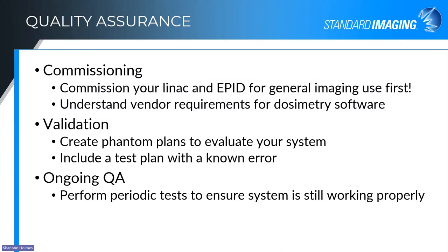Make sure it's working well that way, you're comfortable using it that way, and you're getting the results and the behavior from the system that you expect in terms of consistent imaging and alignment of your isocenter from imaging to treatment. These are the important things that we normally would check for imaging use of the portal imager.